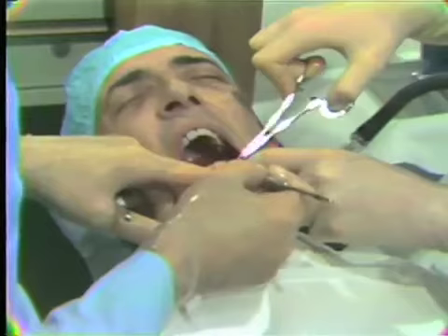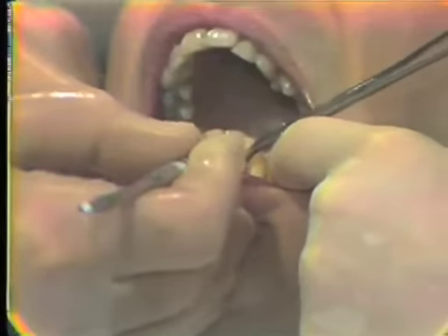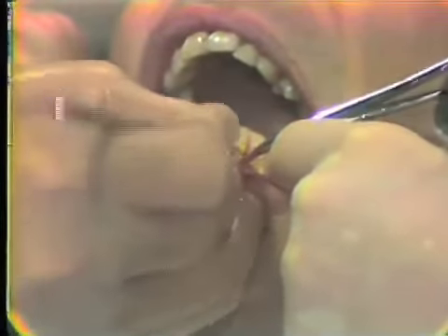There are also times when these small pieces of tissue can be picked up with a mosquito clamp, and again we can then more clearly see the attachment of the tissue, and in doing so we can then get to the base of the attachment and curette it so that we're able to remove it.